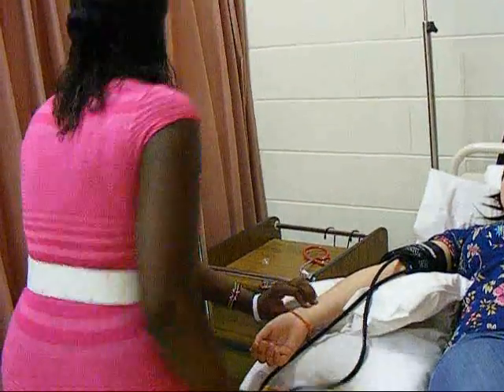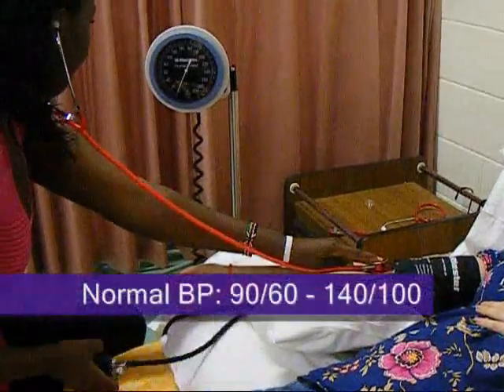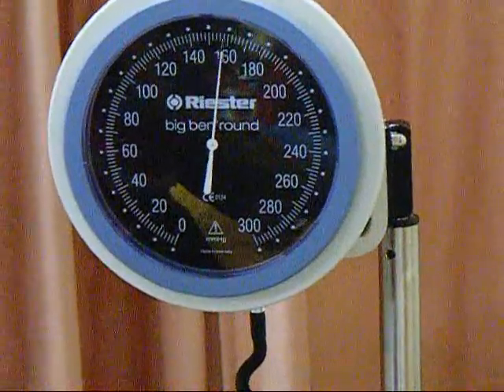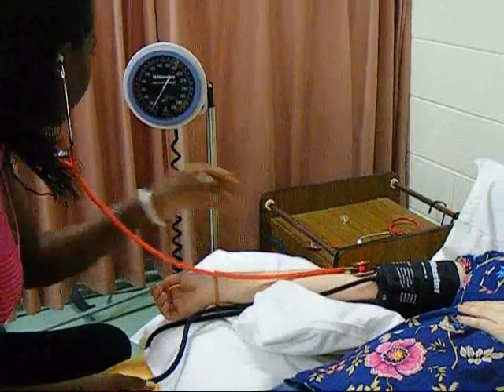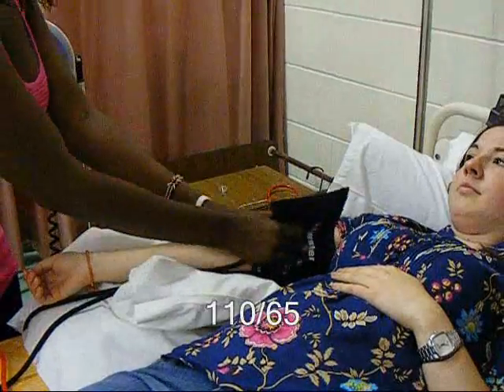Inflate 20 to 30 millimeters of mercury above the estimated systolic BP. Deflate the cuff at a rate of two to three millimeters per second. Record the systolic BP to the nearest two millimeters when a regular tapping sound is heard — Korotkoff sound phase one. Record the diastolic BP to the nearest two millimeters when the sound disappears — Korotkoff sound phase five.